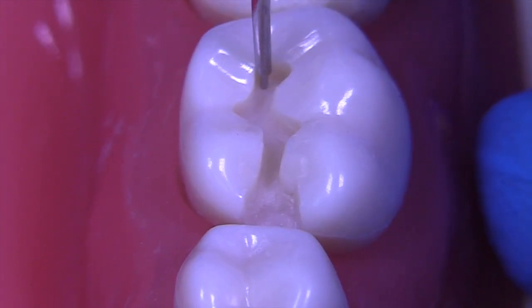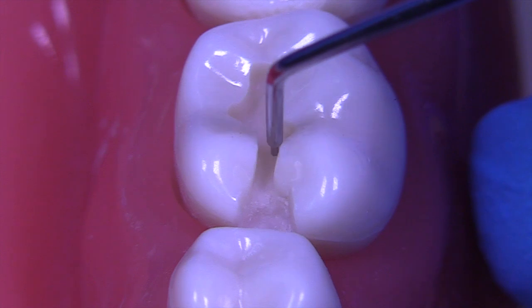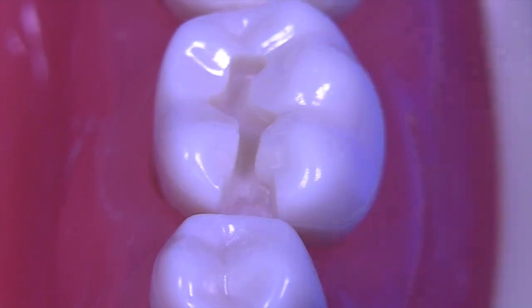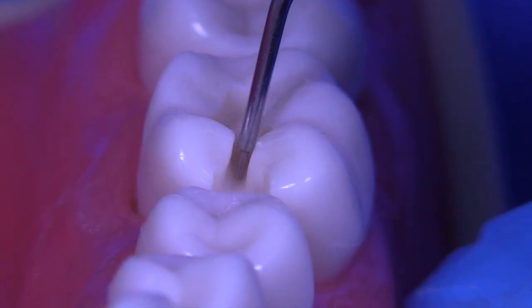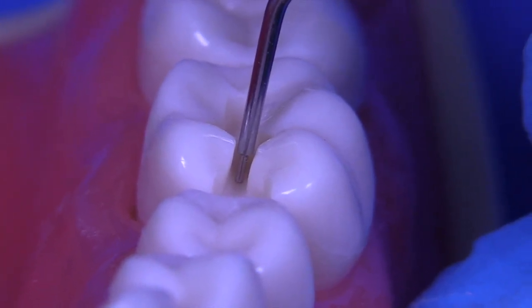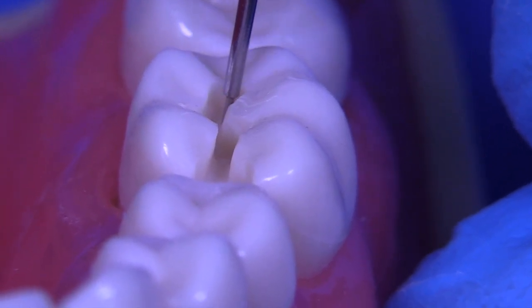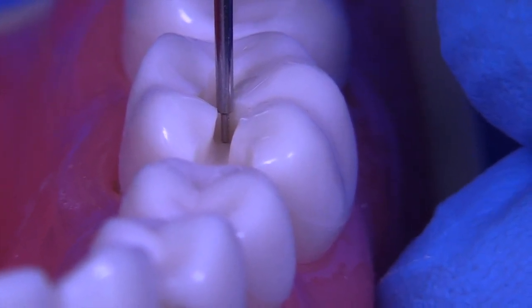Sometimes, if you run the RGS instrument up against one of the walls, it'll show that it's less than 1.5, but not so in this case. This one actually looks quite good. So I think you did a nice job. The only thing I notice when it comes to the orientation of the depth is that you tipped your handpiece towards the facial. So rather than holding the handpiece slightly lingually oriented, your convergence divergence situation places the handpiece off in this direction, which would make you have an error in the orientation of the way the burr was held with respect to the tooth.